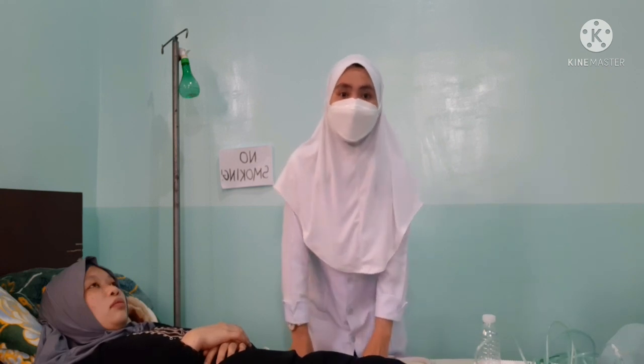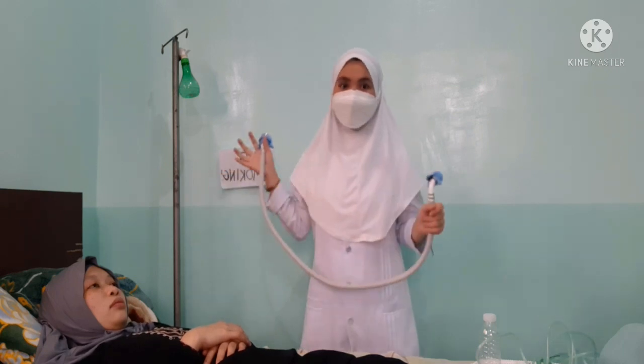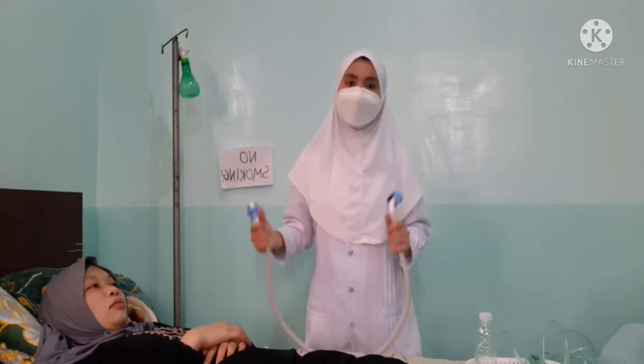And now for the tracheostomy collar. So this is our tracheostomy collar. Connect the tracheostomy collar to large bore oxygen tubing and to the humidified oxygen source. Mist should always be visible. So attach the large bore tubing coming from the oxygen source to the swivel adapter of the collar and ensure that the nebulizer delivers a constant mist.